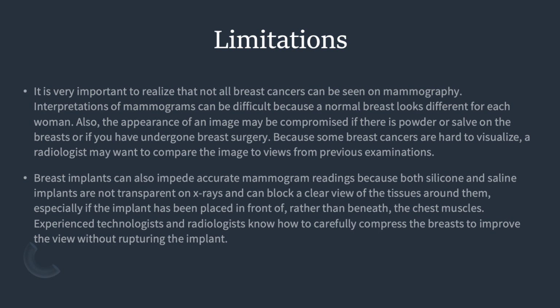It is very important to realize that not all breast cancers can be seen on mammography. Interpretations of mammograms can be difficult because a normal breast looks different for each woman. Also, the appearance of an image may be compromised if there is powder or lotion on the breast or if you have undergone breast surgery.